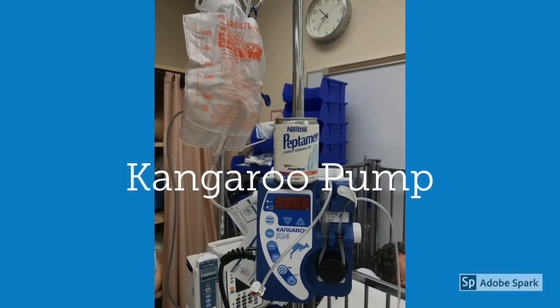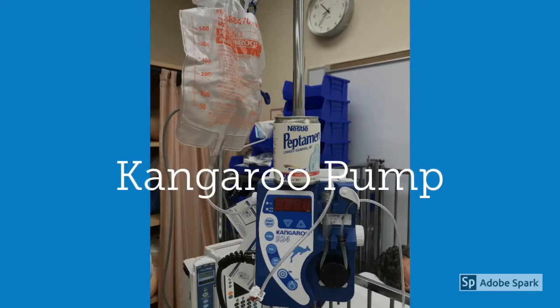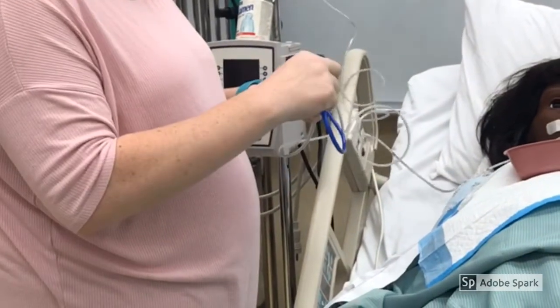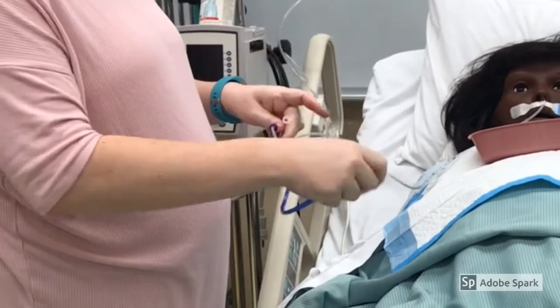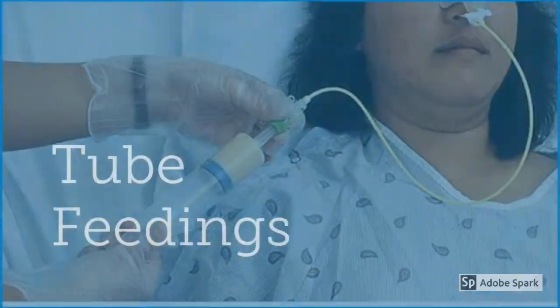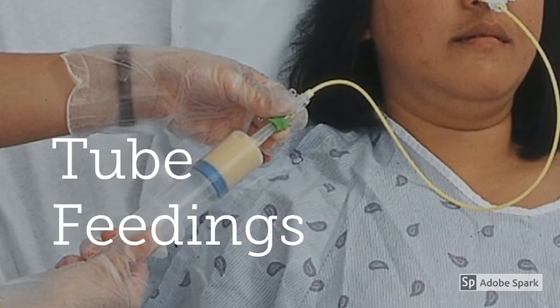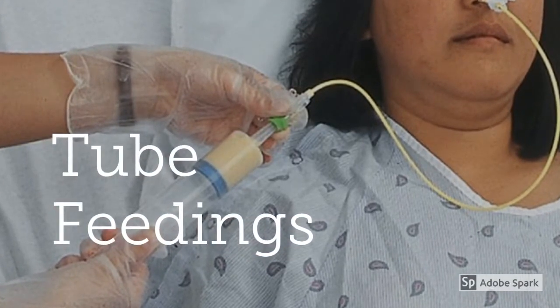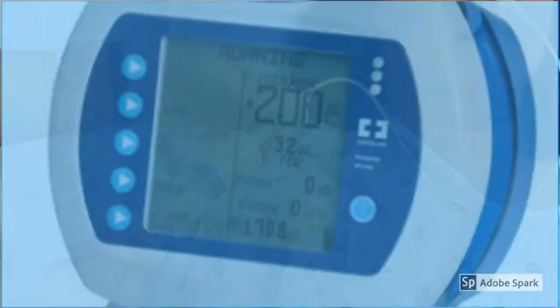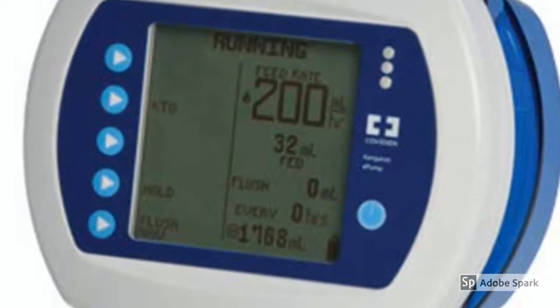If the patient is on continuous feeding, set the pump according to the doctor's orders. Once the pump is set, connect the tubing from the pump to the NG tube. If your patient has an order for continuous feeding, be sure to check and document residuals according to your hospital policy. Also be sure to document the amount of intake every hour. Check doctor's orders for the rate. Use your nursing judgment to increase or decrease the rate. If residuals are more than 200 mL, hold feedings or decrease the rate according to your hospital policy.